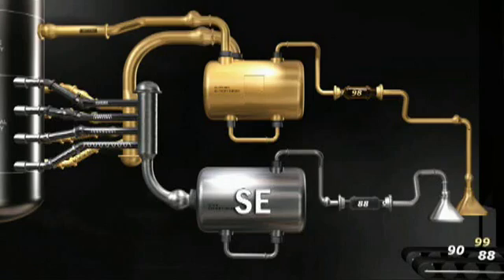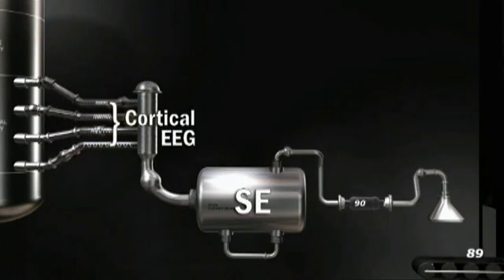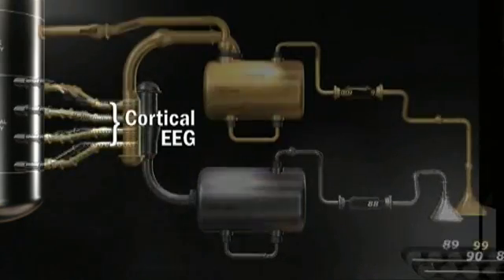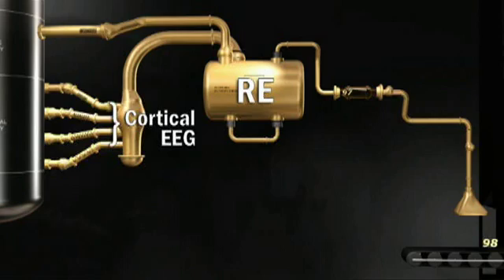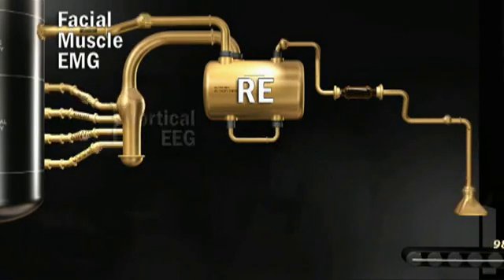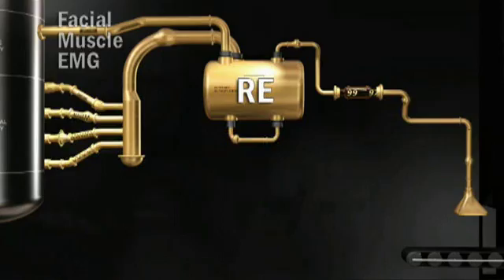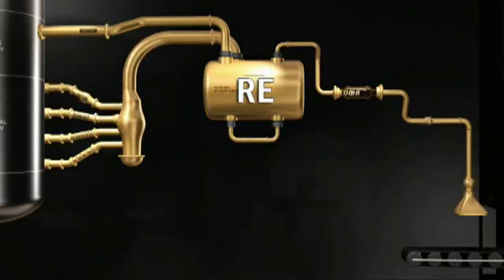These engines use the signals from the transformer and calculate the two entropy parameters, response entropy and state entropy. The state entropy is derived primarily from the cortical EEG and may provide a stable indication of the hypnotic state. The response entropy uses the added information from the facial muscles found in the higher frequencies. The facial muscles are connected to the deeper structures of the brain and react very quickly to such things as a noxious stimulus. So the RE may be an indication of a response to a stimulus.